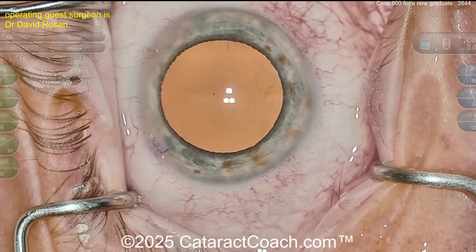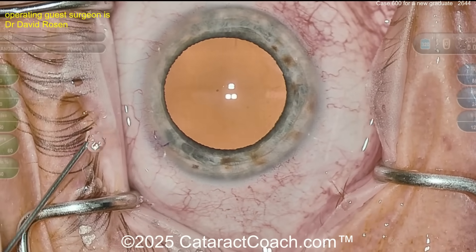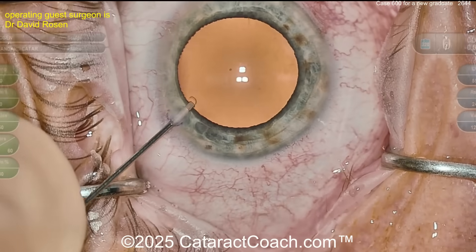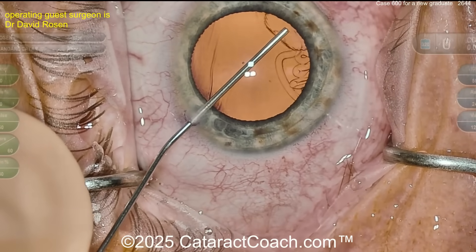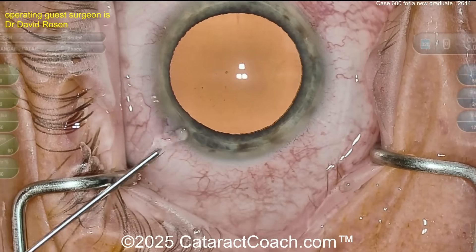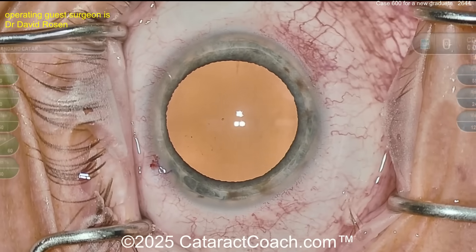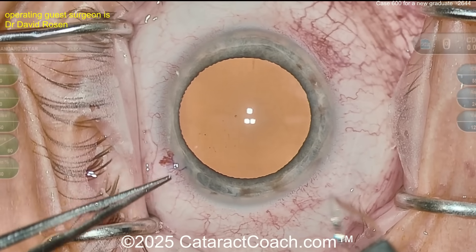You may be saying where's the cataract — it looks so clear, look at that red reflex. Modern day microscopes have such a great red reflex that it kind of washes out any of the lens opacities. Here comes our viscoelastic, probably a dispersive agent going across the AC — beautiful, and a backfill. Look at that wave — fantastic. Looks great. I bet Dr. Rosen has enjoyed some Cataract Coach videos; nice technique, looks really familiar.